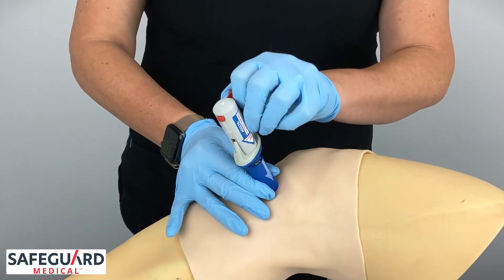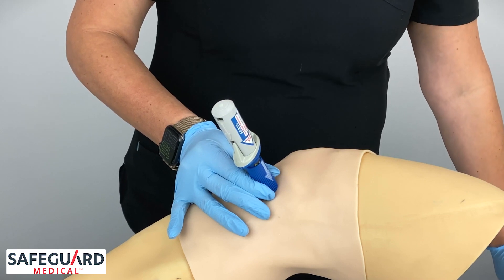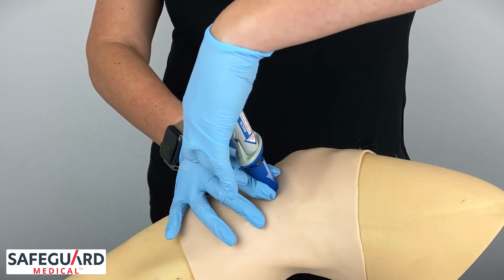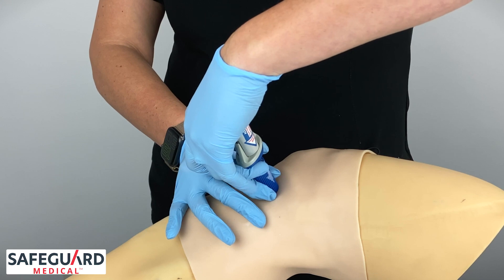Squeeze and pull out the red safety latch — do not discard it. While continuing to hold stabilization, this is a two-handed procedure: use the palm of your hand to press down firmly. This will deploy the BIG.